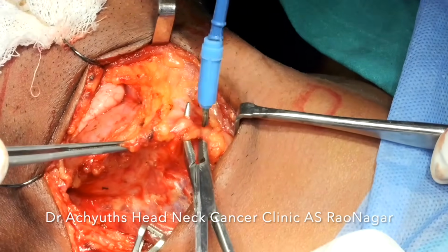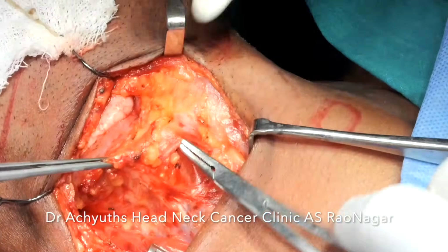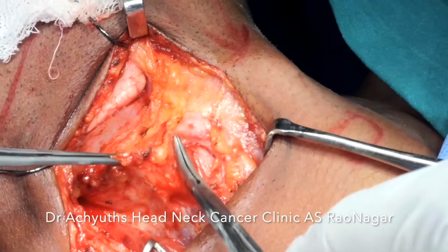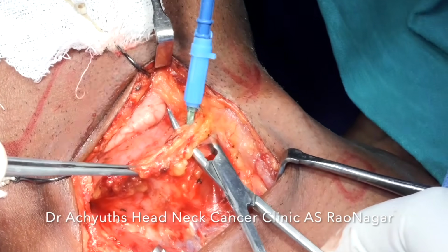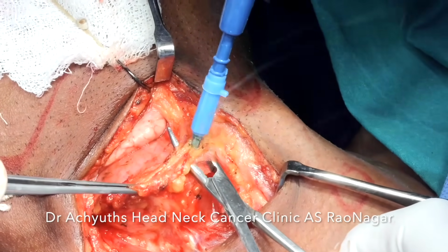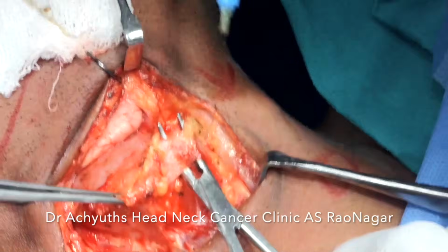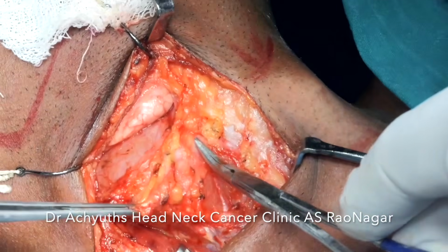Then we will have the hyoid bone attachments, the thyroid cartilage attachments and all. As I told you before, the important vasculature which we are concerned with here is the superior thyroid pedicle and its branches, that is the superior laryngeal artery and the internal laryngeal nerve that will pierce through the thyrohyoid membrane. Here the thyrohyoid membrane anatomy is distorted because of this communication of the external and internal component.